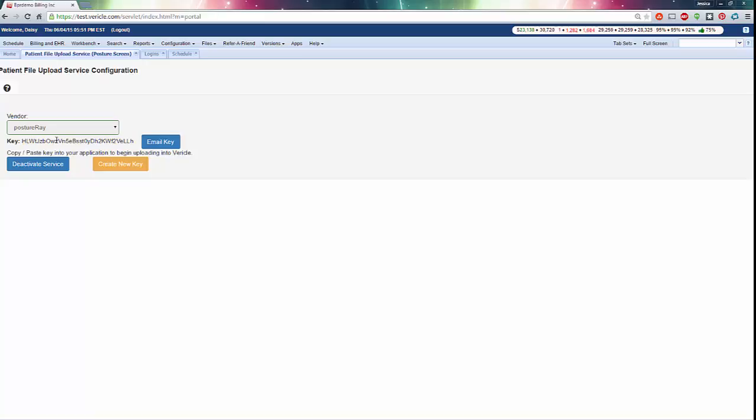If you're going to use both Posture Screen and Posture Ray, you will need to set up each service under a different login, as each login is limited to using a single upload service. You will be able to see the uploads from either service within the patient account files tab.